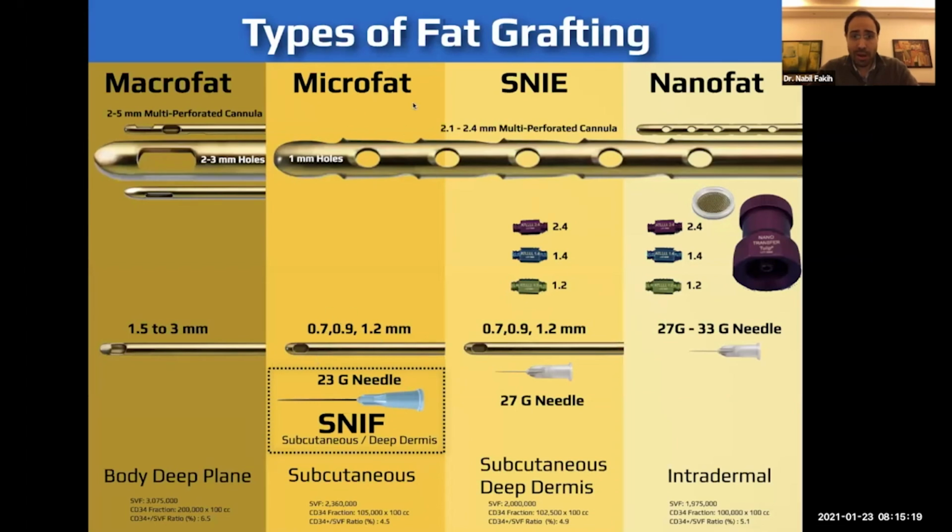If we want to inject microfat with a needle, we call it SNIF, sharp needle intradermal fat grafting. This was published by Dr. Tonnard, and normally we inject it with a 23 gauge needle. Then for SNIE, we first have to do liposuction, harvest the fat, then use 3 emulsifiers from bigger to smaller. I always say ladies first, pink first, then men after, which is blue, and then dogs after, which is green. This is my way of memorizing that: first, next, and next.